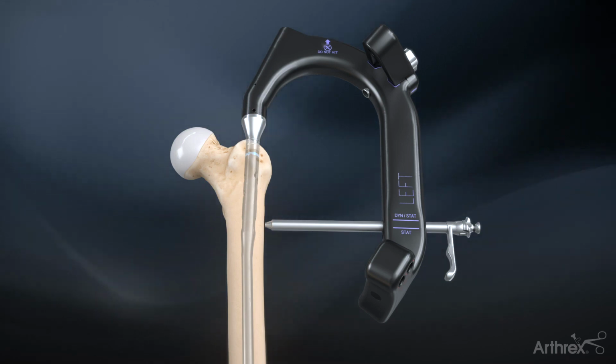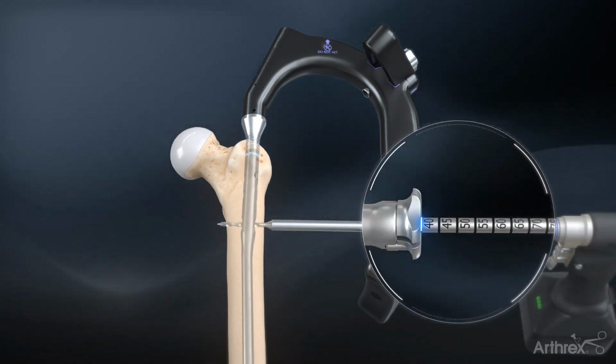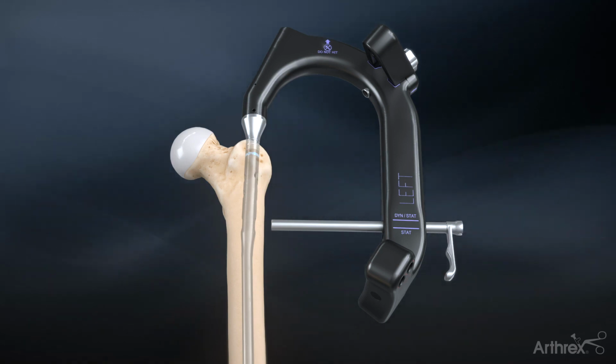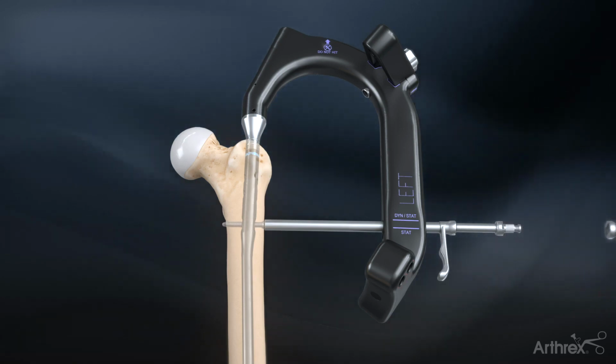Remove the obturator and drill the bone using the 4 mm calibrated drill. Measure the screw length from the end of the drill guide using the calibration marks on the drill. Remove the drill guide sleeve and insert the 5 mm cortical screw assembled on the captured hex driver until the black laser line is flush with the end of the sheath.